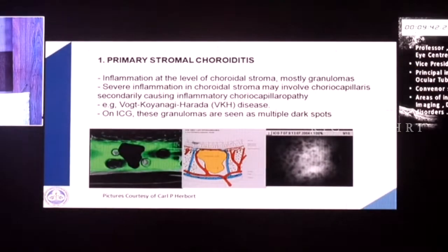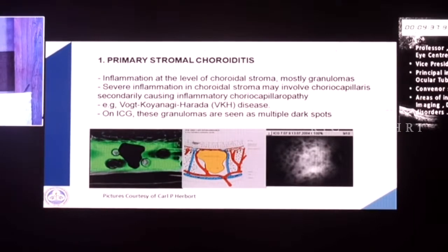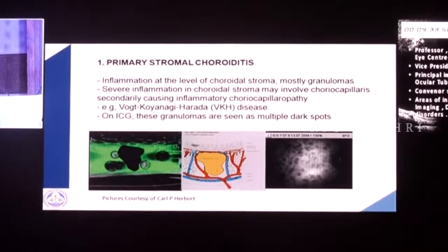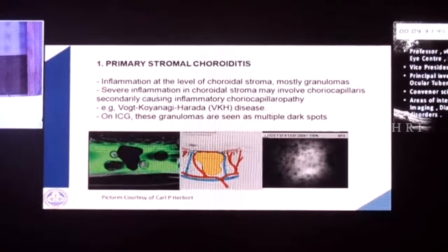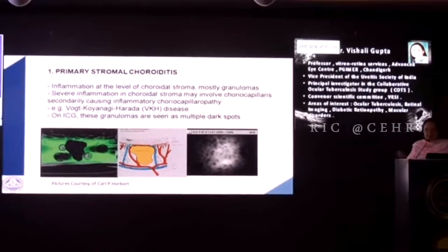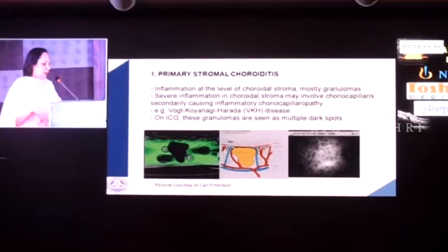Talking on choriocapillaris and how does OCT angio help us in. So let's get back to very, very basic stuff. When we talk of choriocapillary ischemia or choriocapillaris inflammation, it could be of two types.